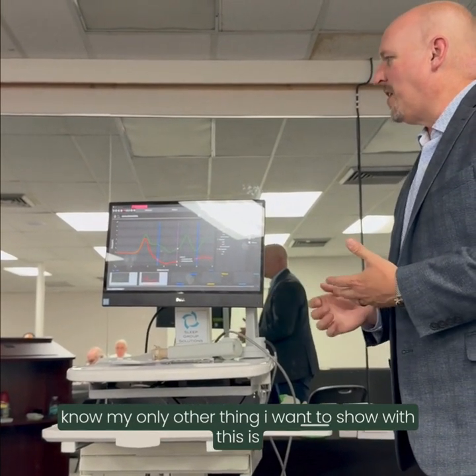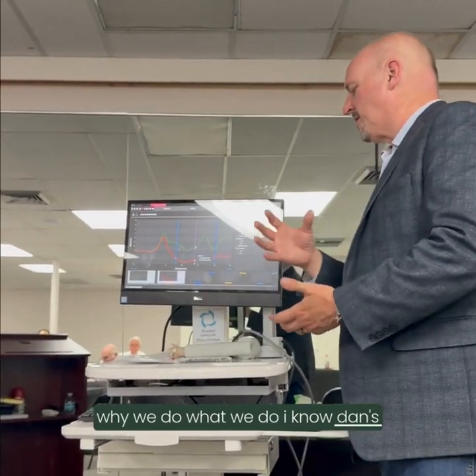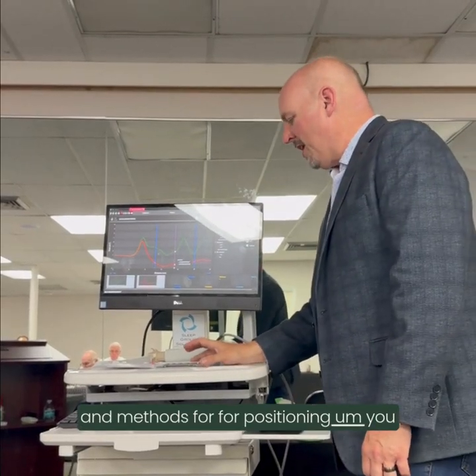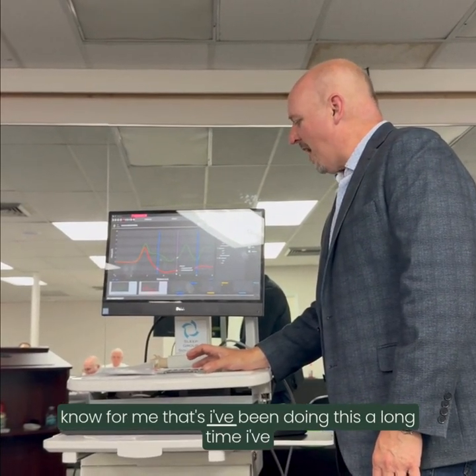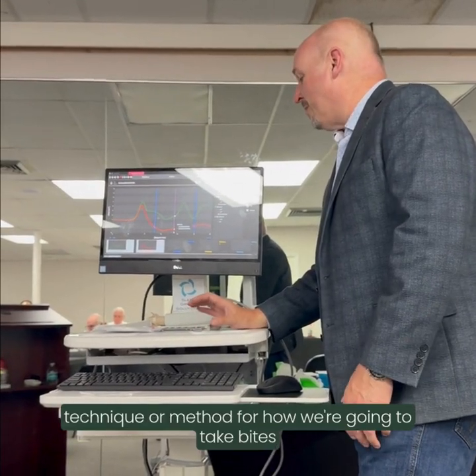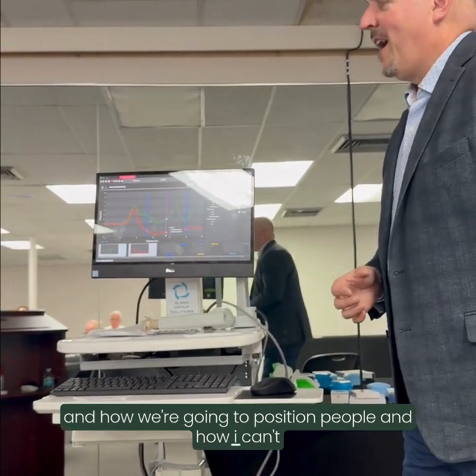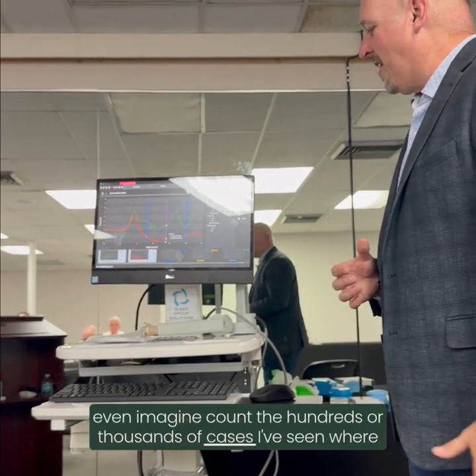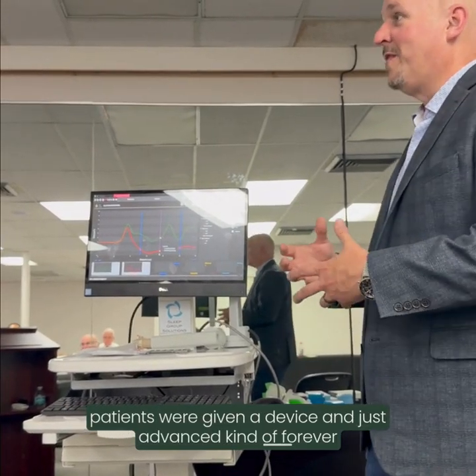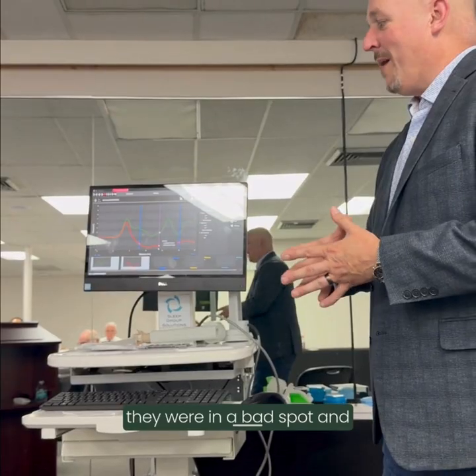My only other thing I want to show with this is the concept or the process of titration, why we do what we do. I know Dan's going to talk about that later too, and different techniques and methods for positioning. I've been doing this a long time. I've seen every imaginable technique or method for how we're going to take bites and how we're going to position people, and I can't even count the hundreds or thousands of cases I've seen where patients were given a device and just advanced forever until something hopefully good happened. And they were in a bad spot.